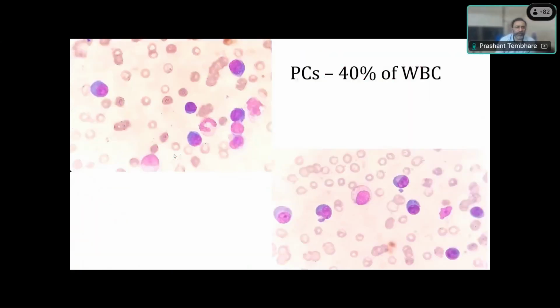Leukocytosis. Yes, correct. Leukocytosis is there. Rouleau formation is there, and in RBC, thrombocytopenia, yeah, possibly thrombocytopenia is there. Maybe we can go to the higher view and you can see. Now, what can you see now?